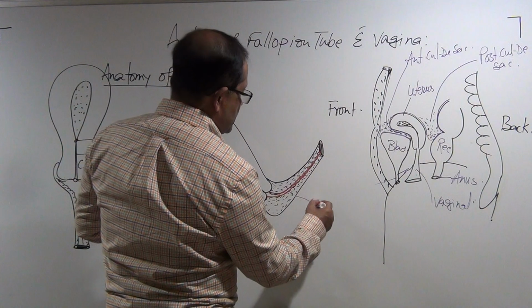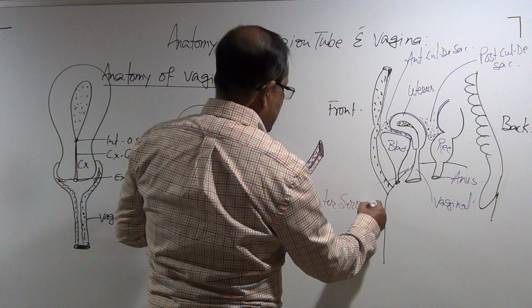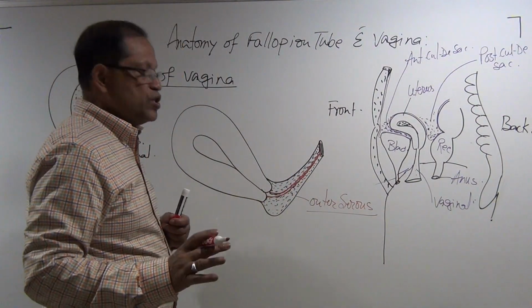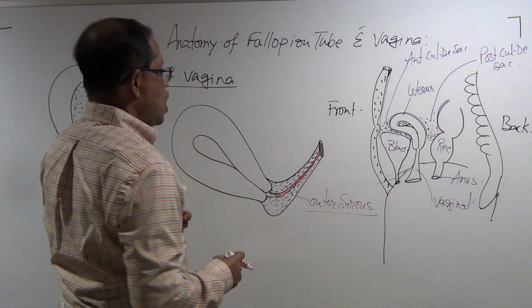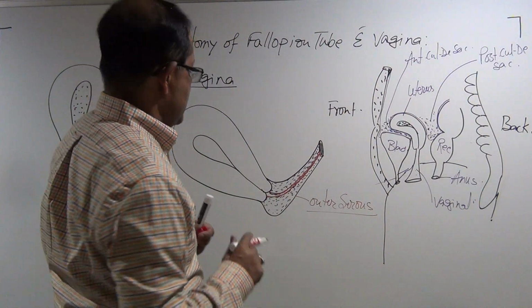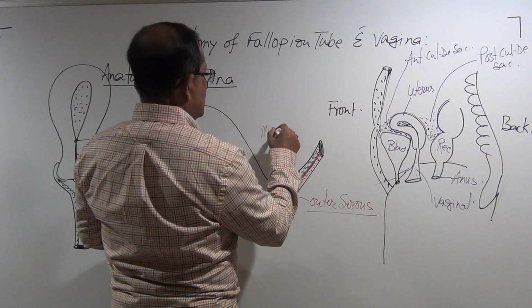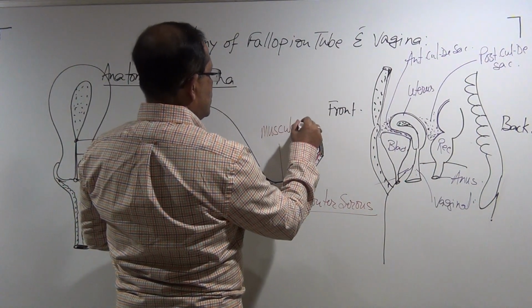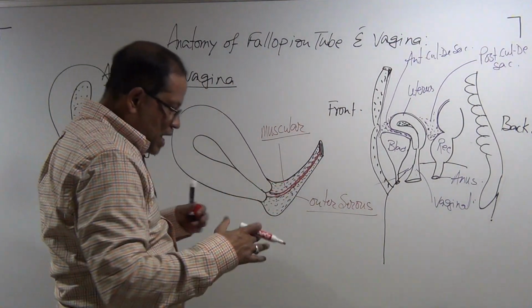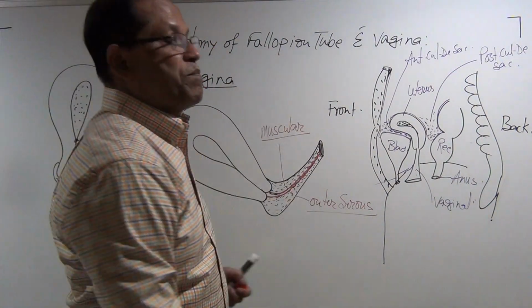This is the outer serous layer, and the serous layer is always fibro-connective tissue, and those are always hyperechoic. All fibroelastic connective tissues are hyperechoic, and this is the muscular layer, and this muscular layer is a membranous type that has the power to be elongated under pressure.